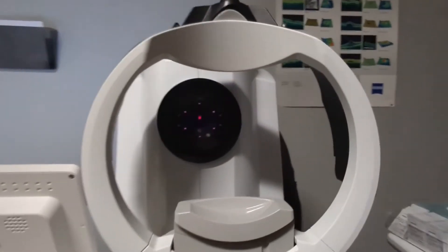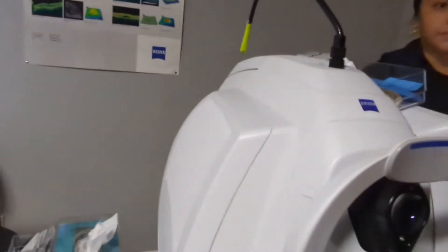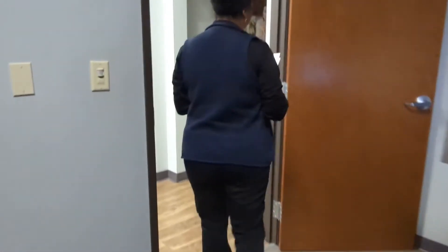Now we're going to move on to our last machine here. Go ahead and have a seat right there. There's going to be a little green star — you'll see it in just a moment. Do you see the green star? Good. Don't move.